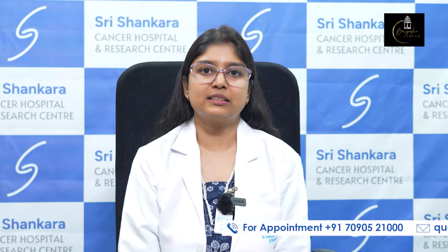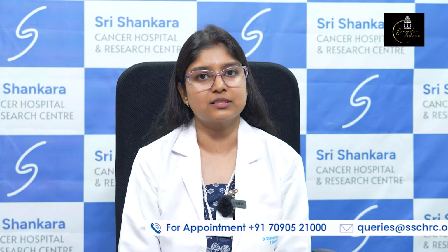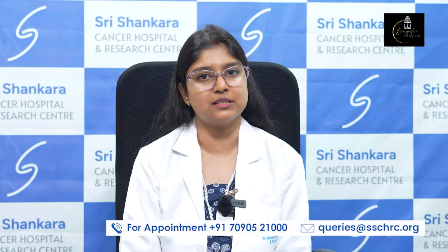Now the other part of diagnostic nuclear medicine includes gamma camera imaging. Depending upon the organ being evaluated, we have different types of diagnostic gamma camera imaging, which includes thyroid imaging, where we can diagnose certain thyroid conditions like hyperthyroidism, like Graves' disease.